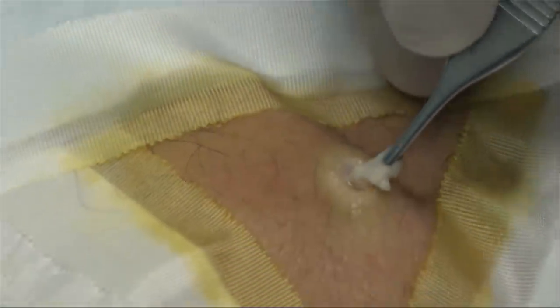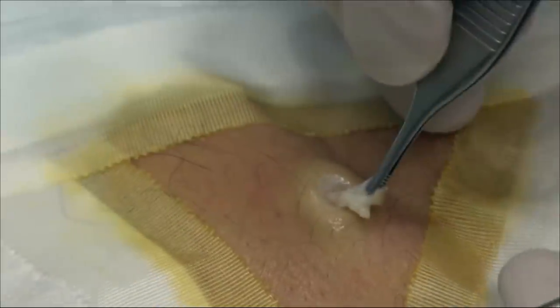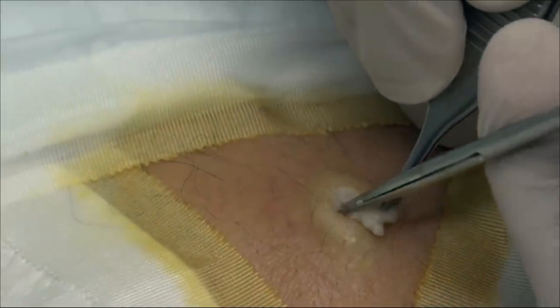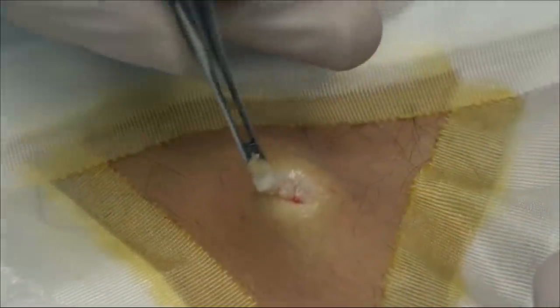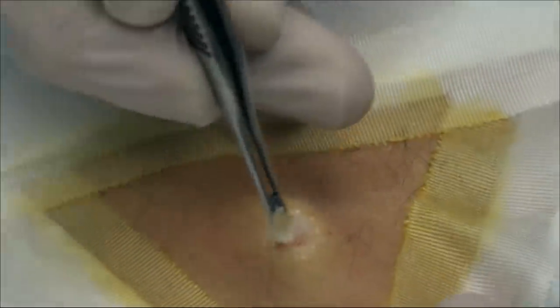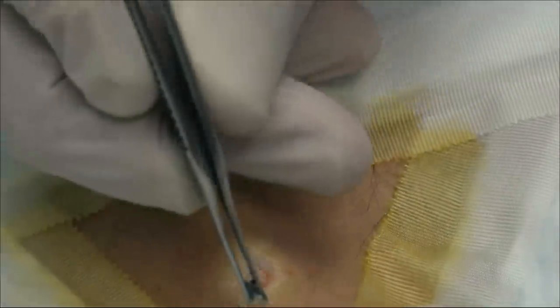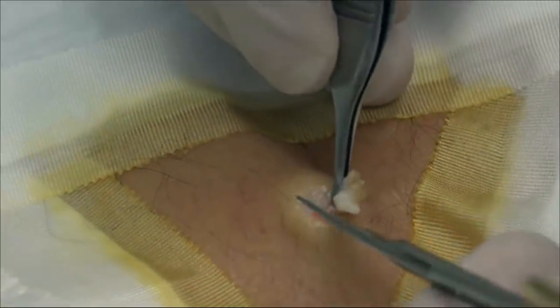I'm gonna just keep tugging on it — it may just come on out for us. Do you feel a little pain? Yeah, I feel a little pressure down here. Pressure? You feel a little tugging? Yeah, that's all you should feel. Did you feel pain? No. It feels strange, doesn't it? Did I get you that time? No, you're all right. Are you messing with me? Yeah, a little bit.